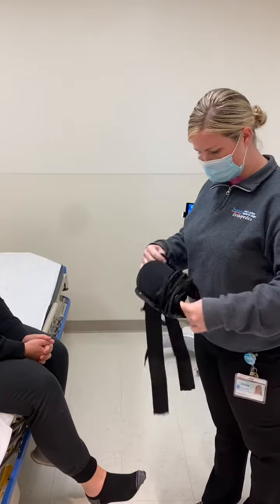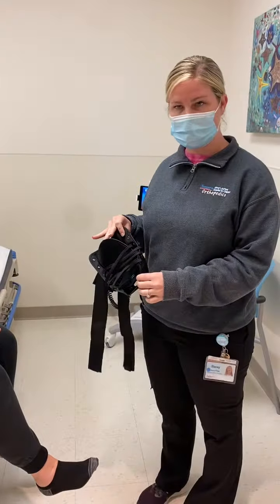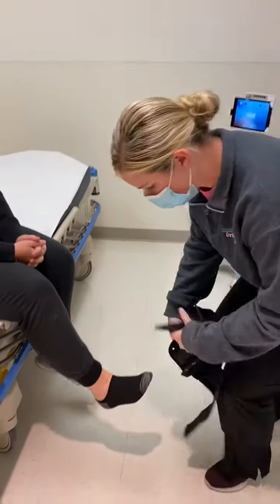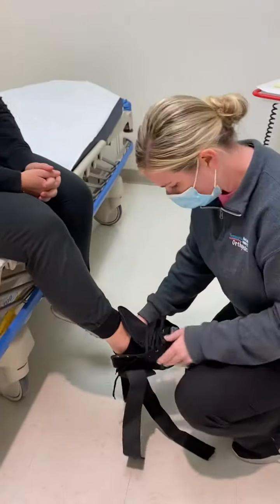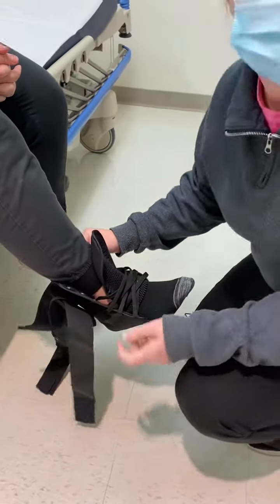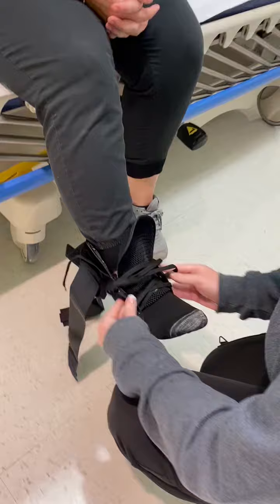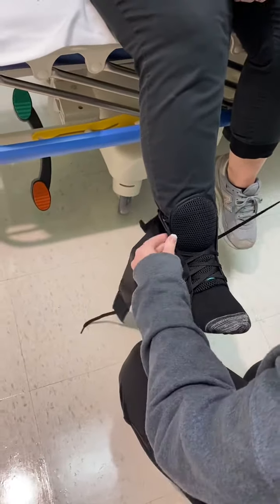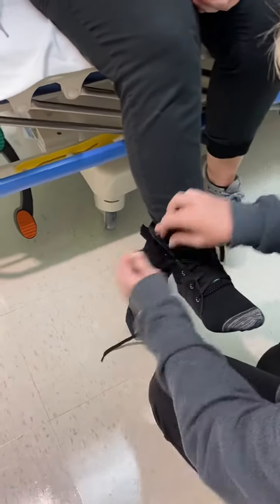You're gonna want to loosen the brace up before you put it on the patient to make it a little easier. They're always gonna wear a sock under the brace, and usually we'll recommend a higher sock so that it comes up higher like the brace. You want to make it tight around their ankle, and it usually comes out of the box not fully laced — you want to lace it all the way to the top.